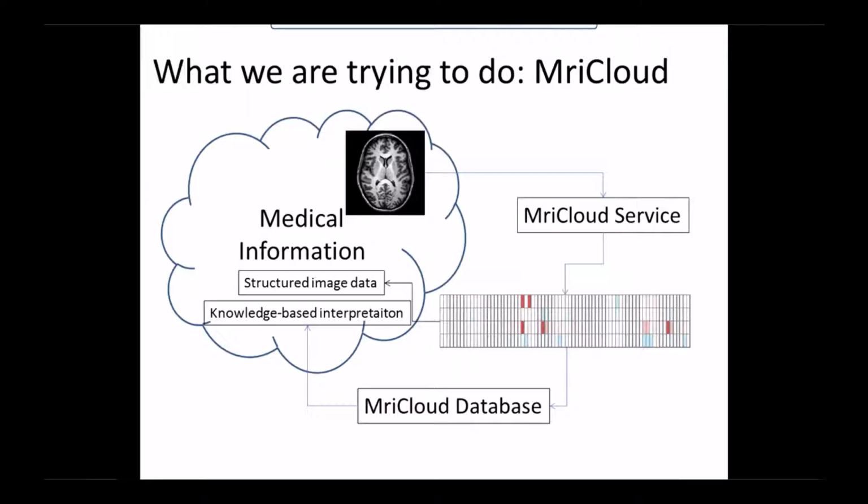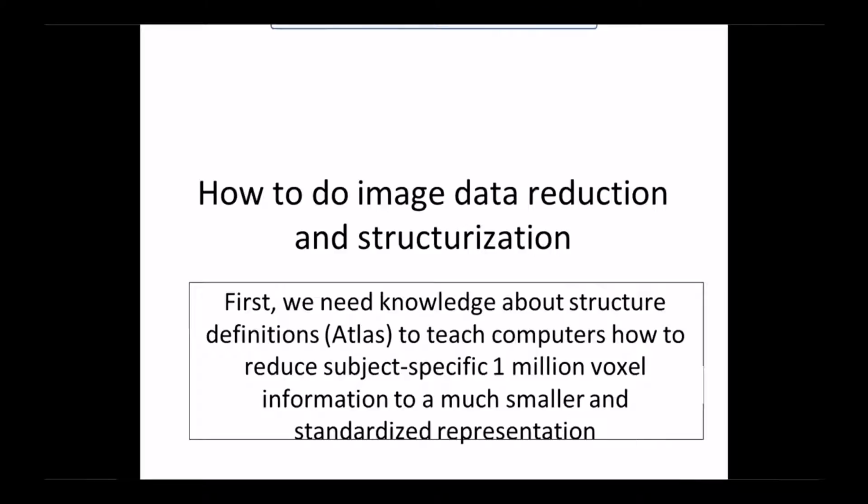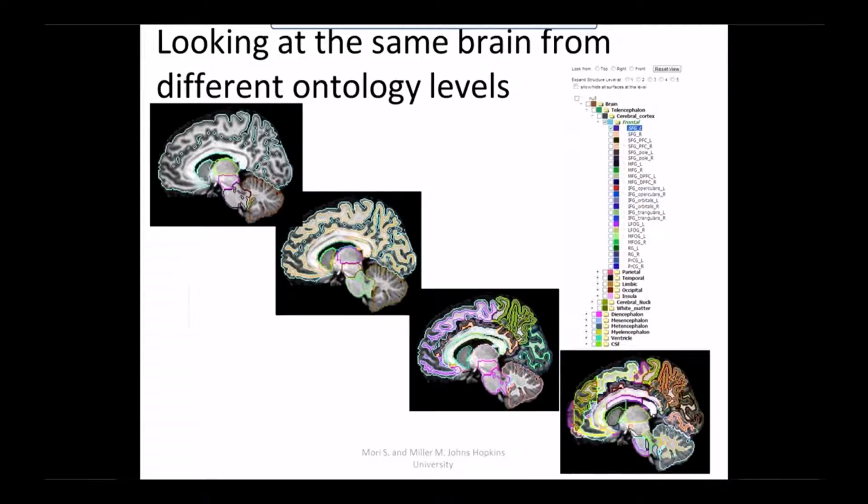And if you have available statistics, then you can take a modality and a structure, and you can ask, how does this structure in that modality compare to a big database? For the parts of the index that are a large deviation, either small or large or a very different contrast, you can annotate it. Here we show in different rows, bright red, which means 3 standard deviations, and less red might mean 2 standard deviations. You now essentially have a way of starting to score automatically and build indexes that have statistics built into them, and you can load this into your database and then come back to the database and query it. And so that's the idea of the cloud.